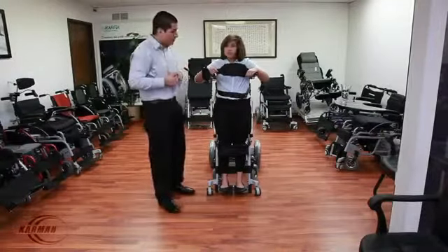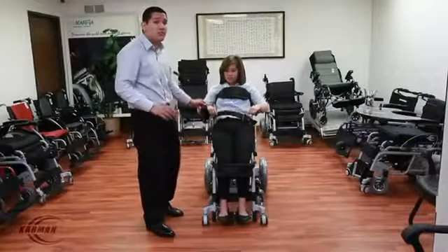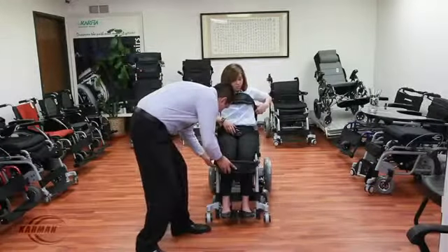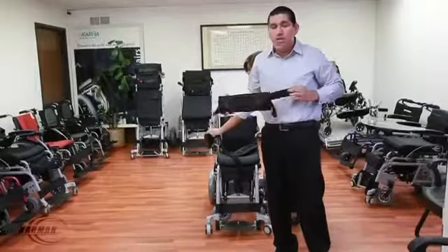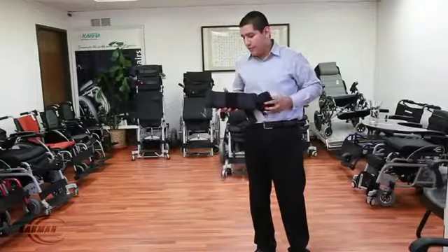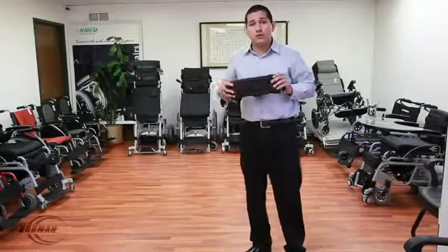These are the three key important safety factors for this chair. We're going to go ahead and sit her down. Once again, from standing to sitting position in just 14 seconds — this is our XO202J model, junior, 14-inch seat width. As I mentioned, this is the knee wedge. This knee wedge is adjustable — you're able to adjust how wide, how short, the diameter, and the tension. It comes standard with the wedge, but the wedge is removable. Some patients prefer to have the wedge for more support between the legs; some prefer just the strap by itself. It's your choice and personal preference, but it is available for added safety.